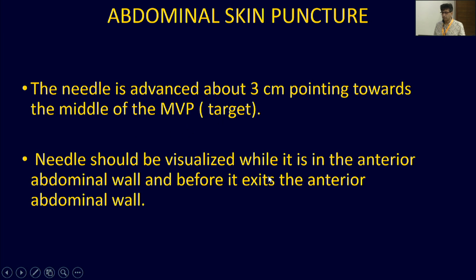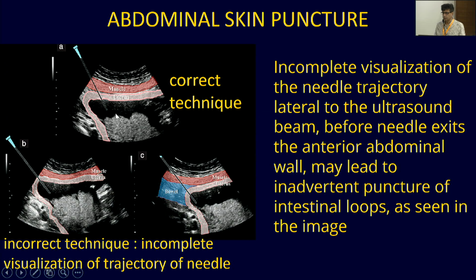Now, while it is in the anterior abdominal wall, the needle should be visualized before it exits the anterior abdominal wall. So while we are in the wall, it has to be visualized.